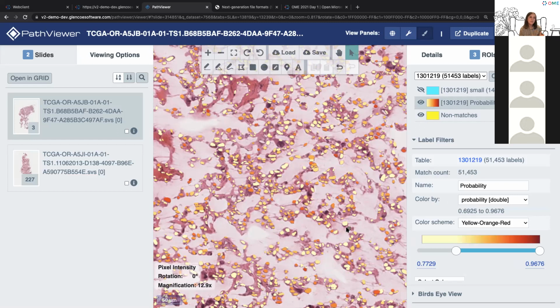And so the reason that we really like this workflow is you can imagine that you generate your segmented objects and you measure 10 things about them, but then you maybe build a classification workflow, and that's a new measurement of sorts. It's a new column where you want to have the classification of those objects. Or maybe you decide, oh, I forgot to measure the shape parameters. I only measured intensity parameters, and so in my next round I want to measure those shape parameters.